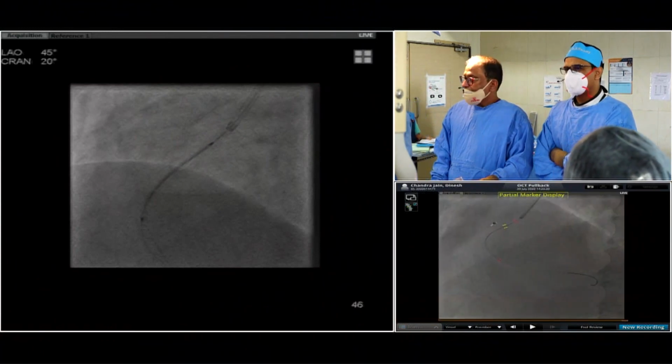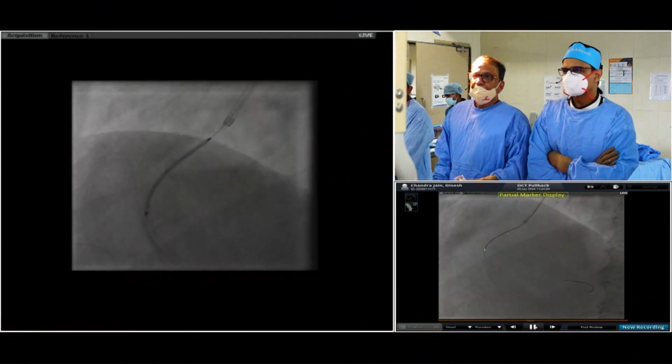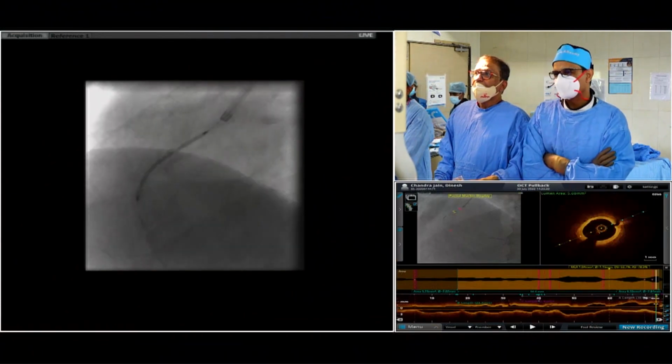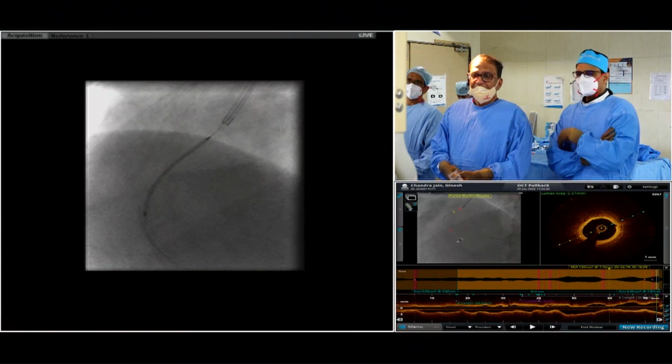Yeah, I know. I have come up proximally. I saw your landing zone. Stent Boost is not ready, Chinna. Okay, so if you implant the stent, change.